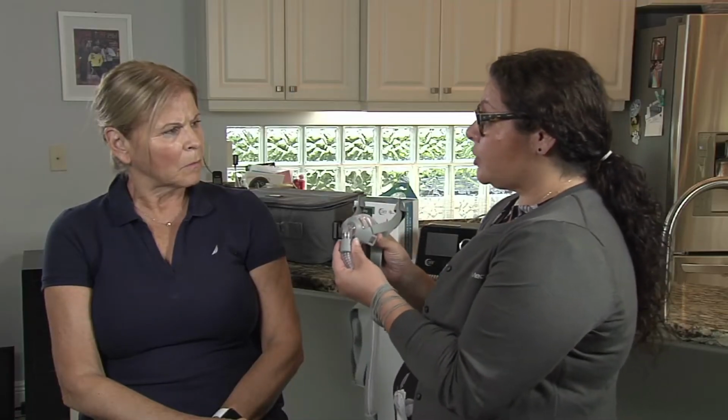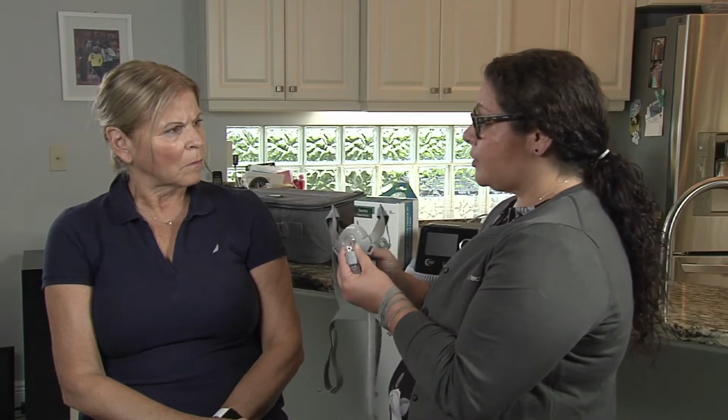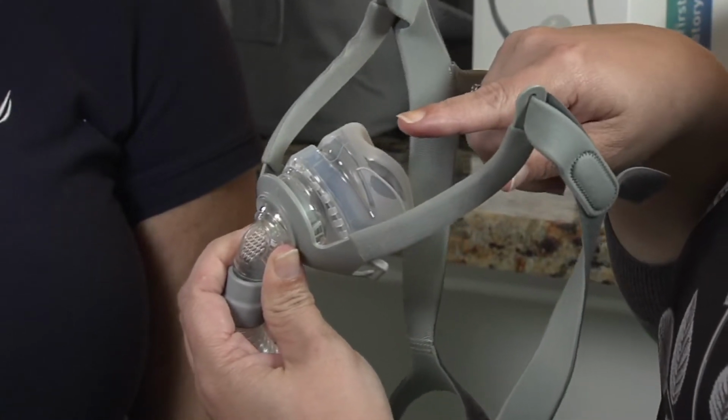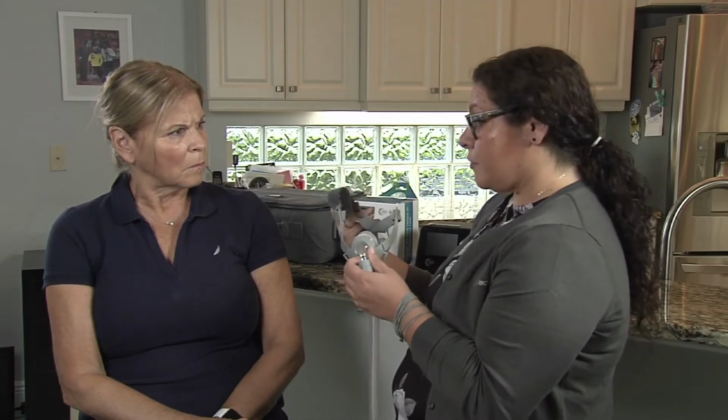We're gonna go ahead and try this on your face. The most important part of wearing a nasal mask is the cushion not pinching your nostrils and encompassing your whole nose. I'm gonna slip this over your head. You'll feel a little pressure on the front of your face.